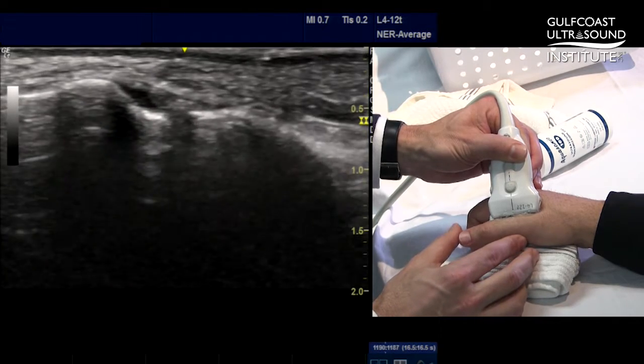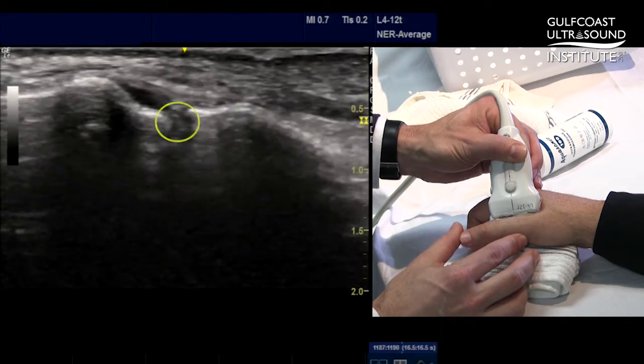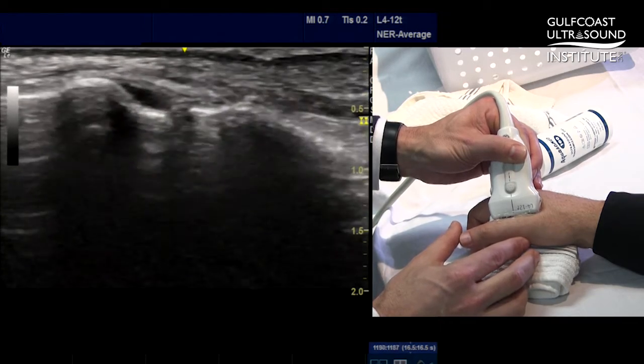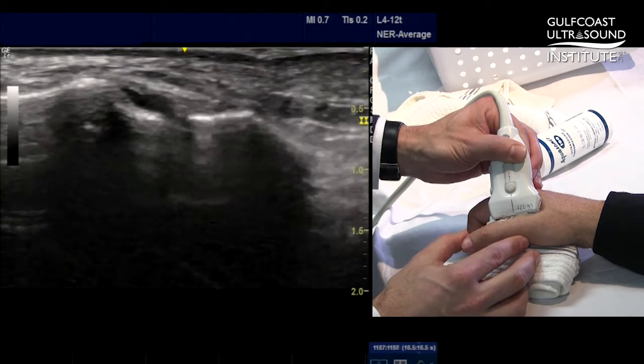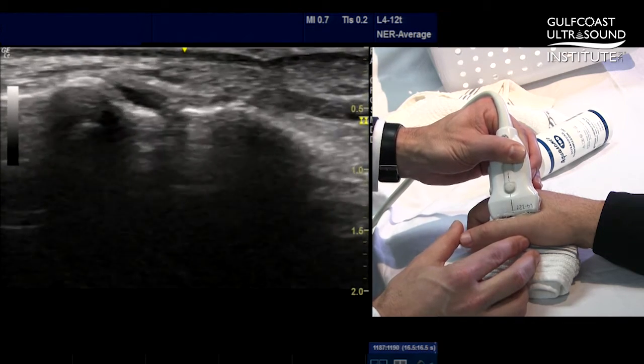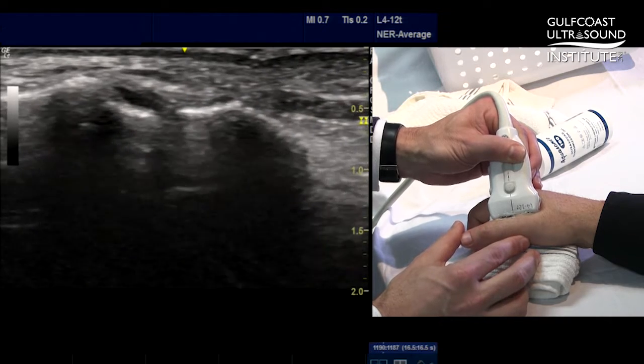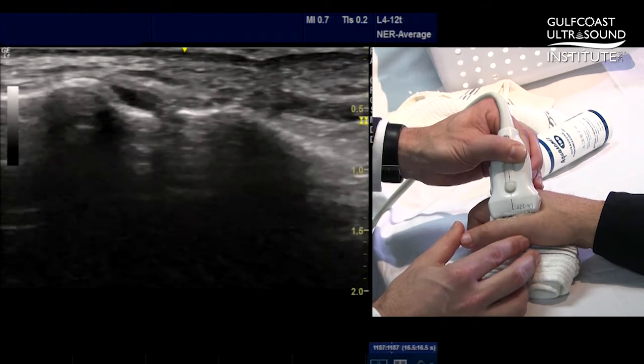As you can see, I'm barely putting any stress across that joint and you can see the joint widening. Now there are no numbers that indicate the normal appearance of this joint and how much it should open, but I find this dynamic maneuver important as it can often force fluid into a tear of the ligament to help with its visualization. So that is your hot tip of the day. Now you give it a try.